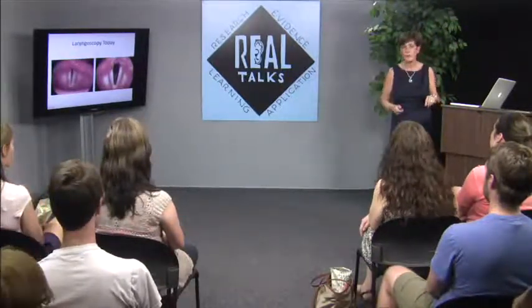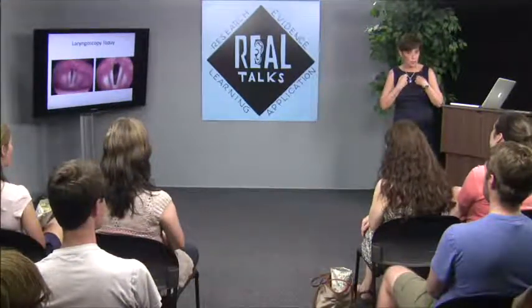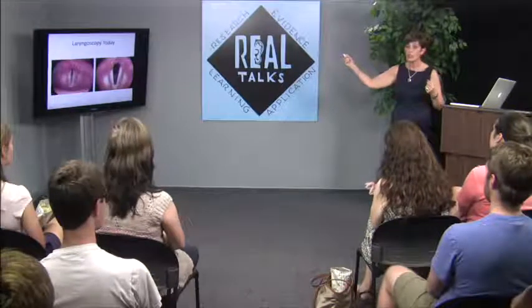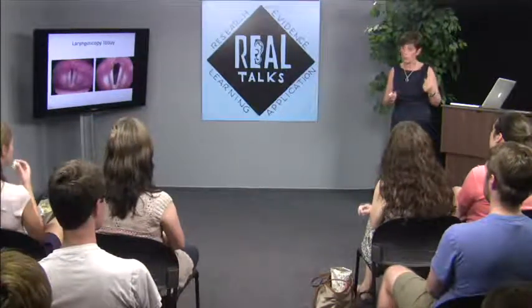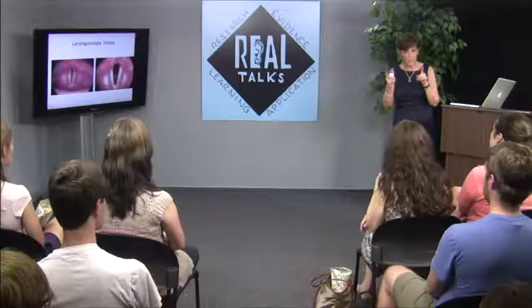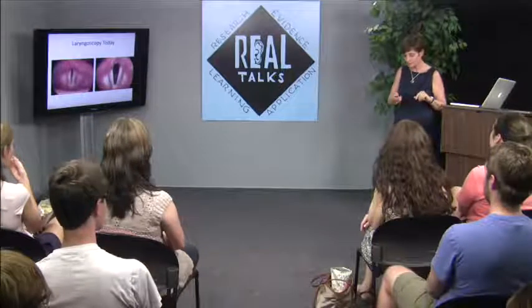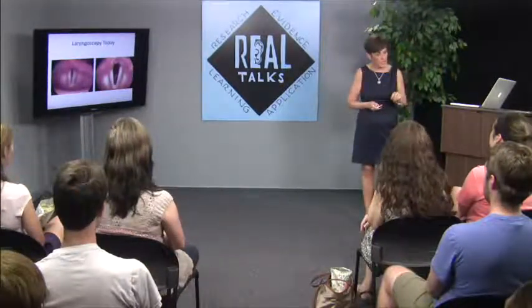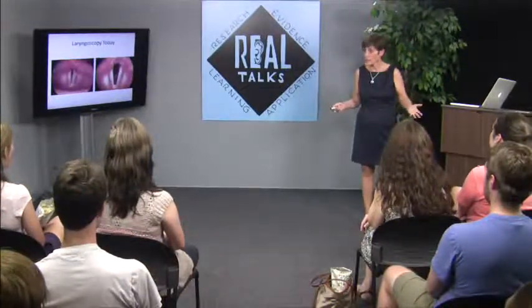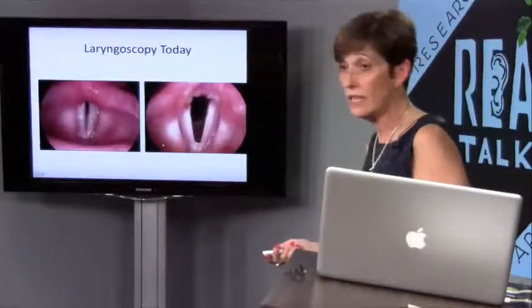I will tell you that video stroboscopy is what's changed our lives, especially as a speech pathologist, because I can look at the pliability of the vocal folds. I don't diagnose lesions. I assess function. And only video stroboscopy allows me to see this. Video stroboscopy is, in my life, something I do 10, 15 times a day, depending on what my clinical day is involved.